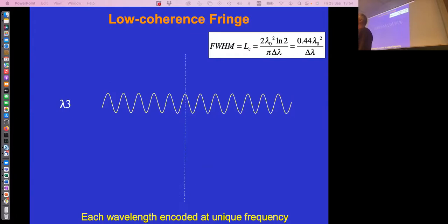And then back and forth, it's half a wavelength. Are the waves in phase or out of phase? 180-degree difference in phase. That's exactly out of phase. Take a cosine maximum. When you go to a minimum, that's 180 degrees, and 360 is the maximum. So a quarter of a wave of mirror movement gives you a half wave path length difference, 180 degrees out of phase, and you would end up with a minimum. So this one then is a half wave of the mirror, a full wave back and forth, and you get constructive interference.